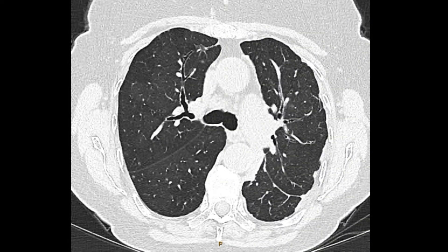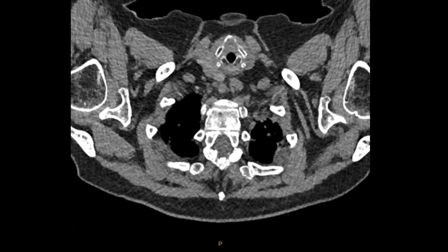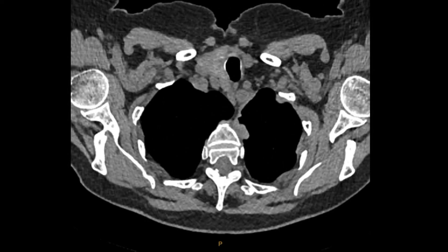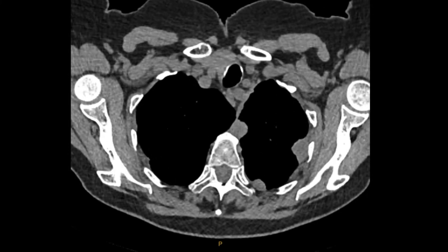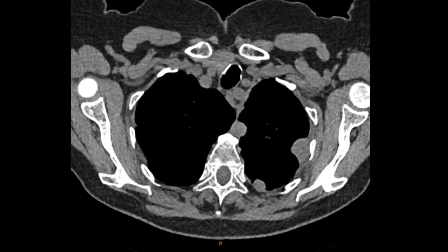Let's have a look at the mediastinal windows. This CT scan has been done without contrast, which makes it a little bit difficult to see the pleura. However, the mediastinal windows do show the pleura a little bit better. Immediately you can see some pleural nodularity — pleural nodules — and a little bit of thickening of the mediastinal pleura, which is usually a good sign that there may be malignancy of the pleura.